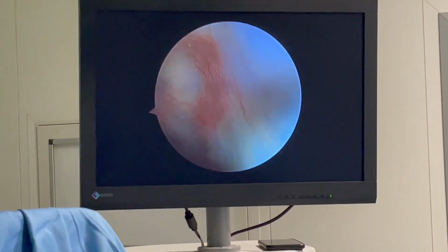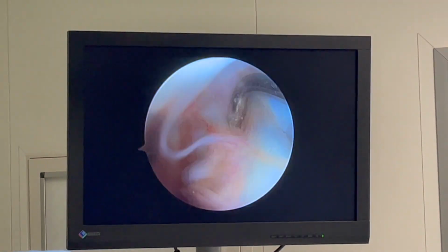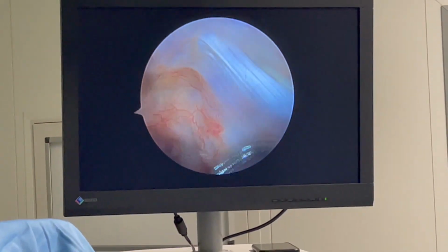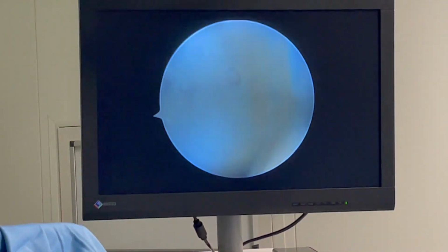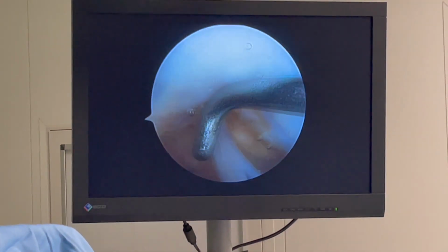Anesthesia. The patient is usually placed under either general anesthesia or regional anesthesia to ensure they are pain-free and comfortable during the surgery. Orthopaedic surgeon Dr. Nihal Fernando in Sri Lanka explains the injury to the patient.